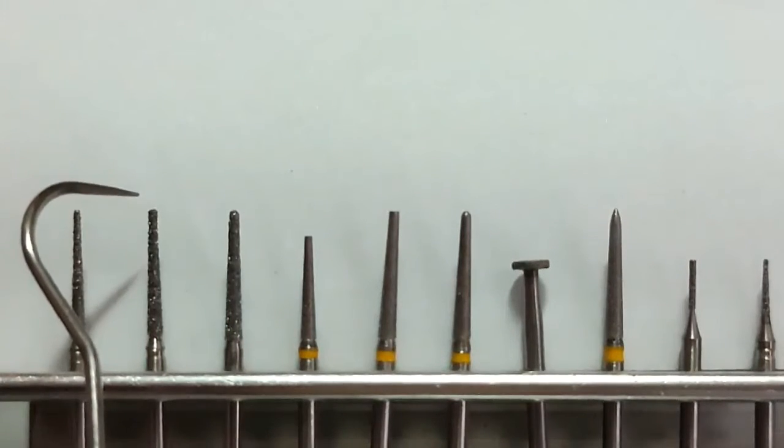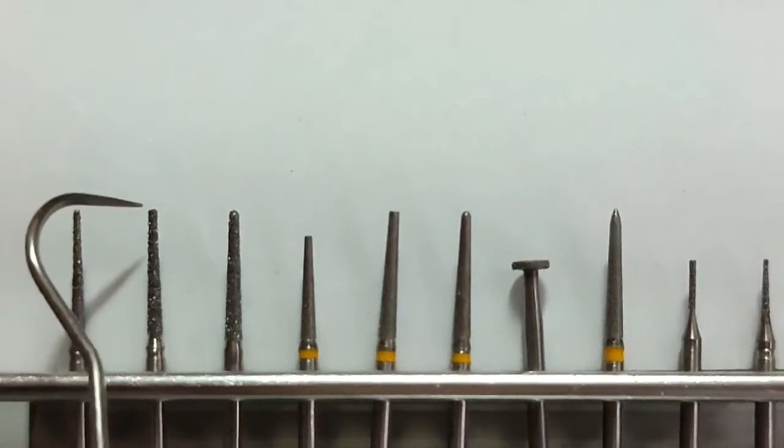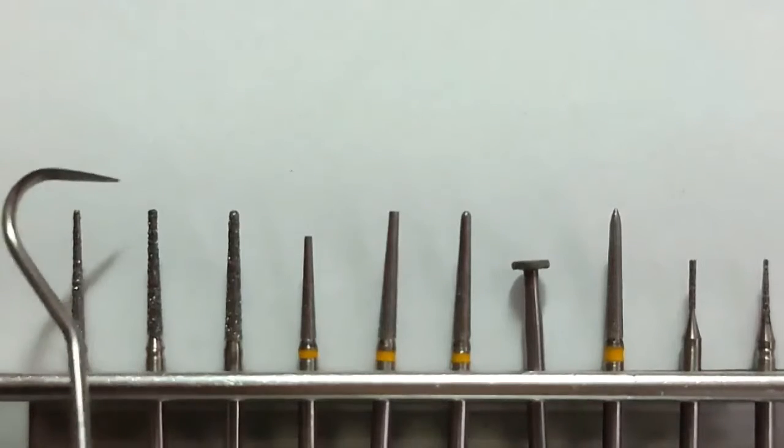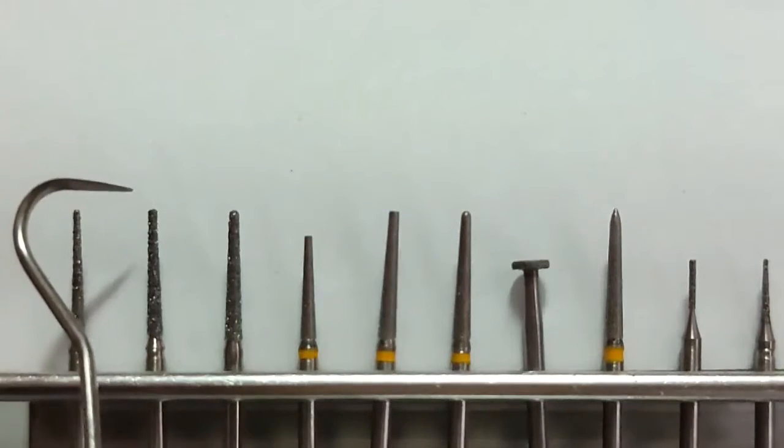And then, beside it, it is a 0.75mm tip flat end burr. So, ito ay both for premolar and molar shoulder preparation.